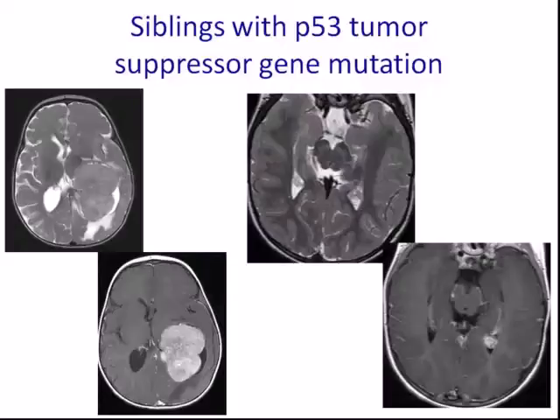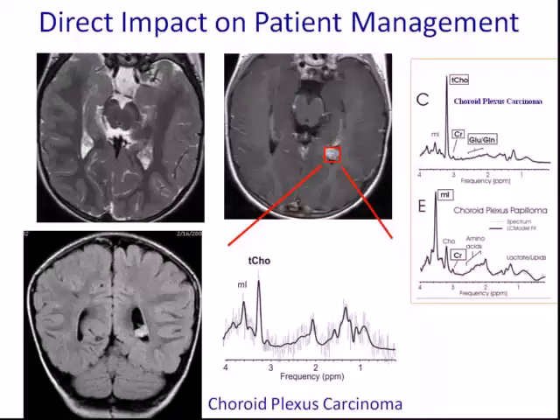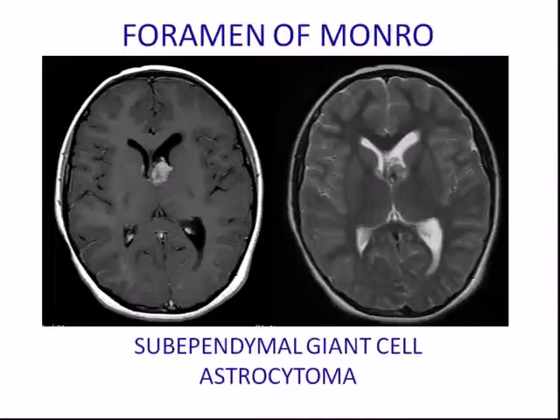And she's a healthy 8-year-old. Do you really want to subject her to surgery or just watch? So we actually did a 25-minute spectroscopy, so you bump the signal average up really, really high. And from that, we felt the spectra was more consistent with carcinoma because the myoinositol was lower, and so they resected and it was a carcinoma. So I do think that there may be some value of spectroscopy as an additive tool to what you're thinking in management.